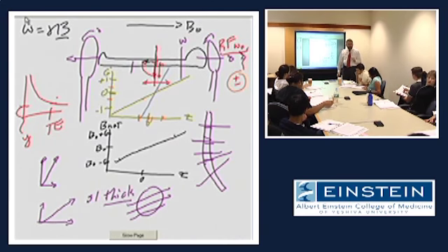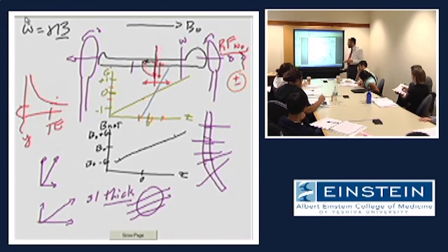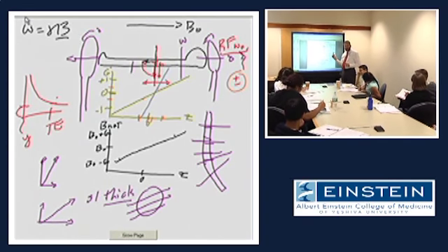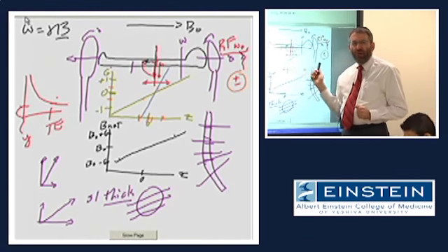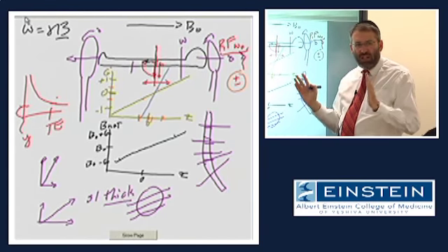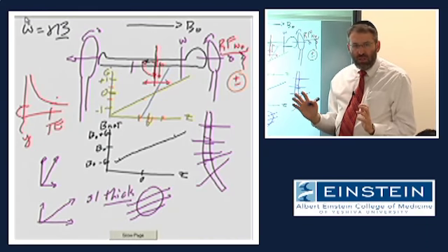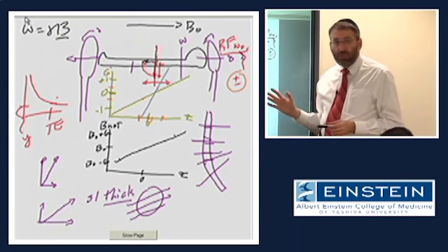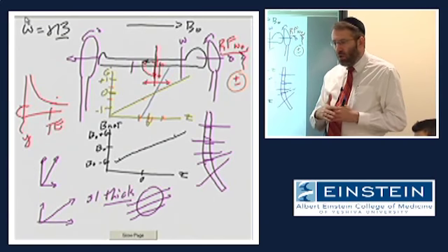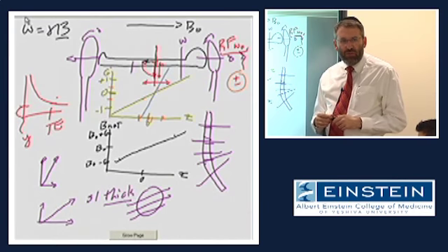Do you ever change the field strength of one gradient with respect to another to change the isocenter? Okay, so that's a good question. The assumption here is that as we change this gradient magnetic field, we're putting the same amount of power into each side. We either increase them both or we decrease them both, but we never only adjust one of them. That's what we call a symmetric gradient magnetic field. And for our purposes, all of the gradient magnetic fields that you're ever likely to deal with are going to be symmetric gradient magnetic fields.